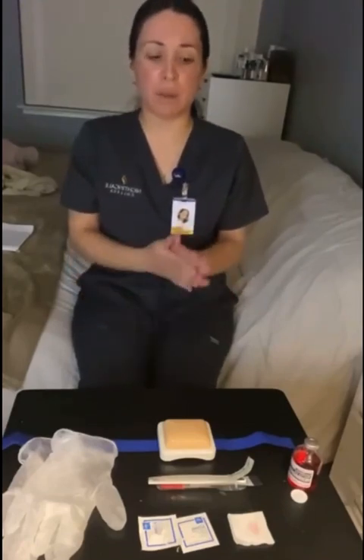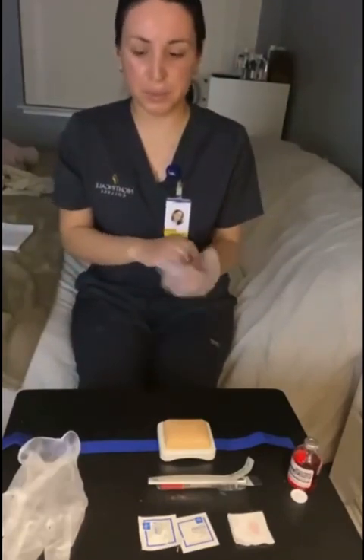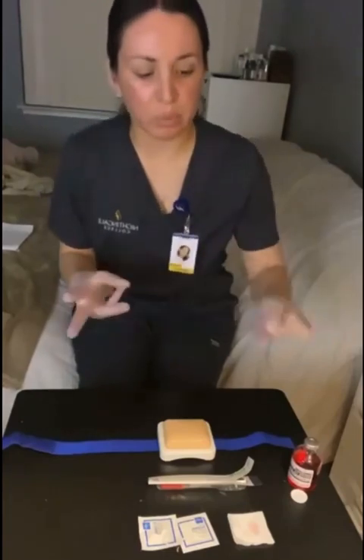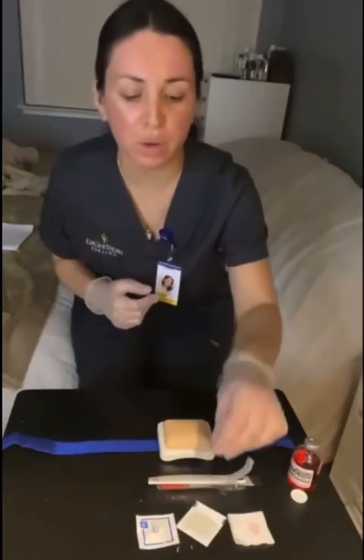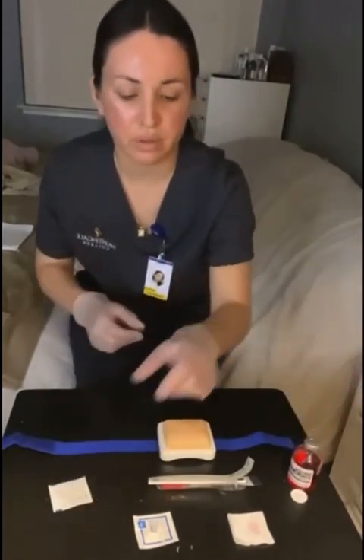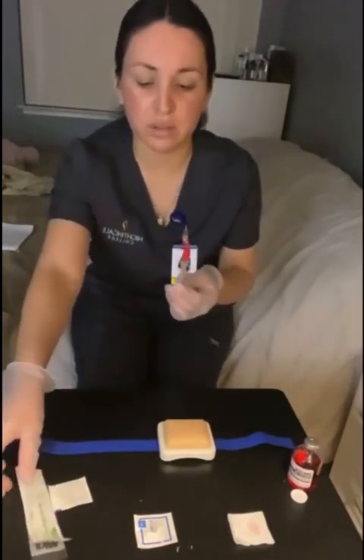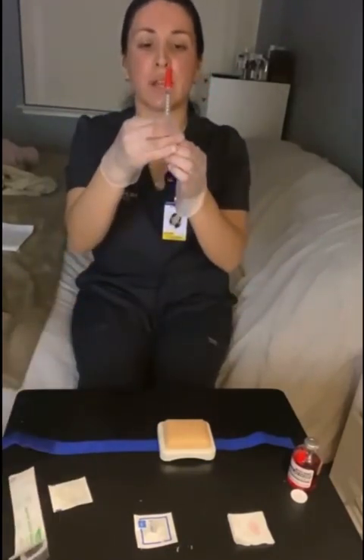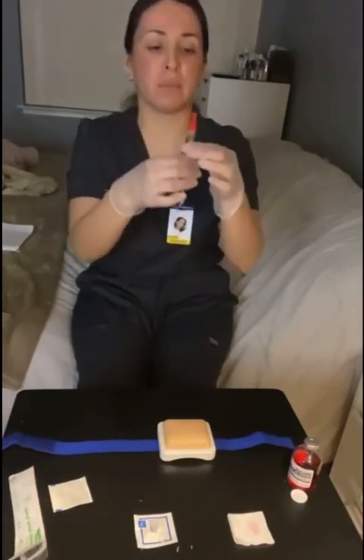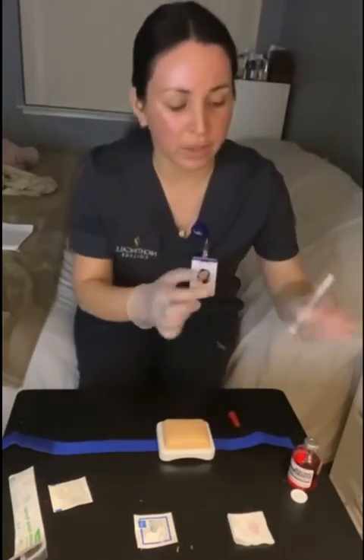Okay, so I'm going to perform hand hygiene and apply my gloves. If it's a new vial, I would remove the cap. I'm going to take my alcohol swab, take it out and clean the top of the cap. I'm going to take my syringe and needle with the cap still on. I'm going to pull back to get air to my correct dose of 0.1. Now I'm going to remove the cap and insert it into the vial.